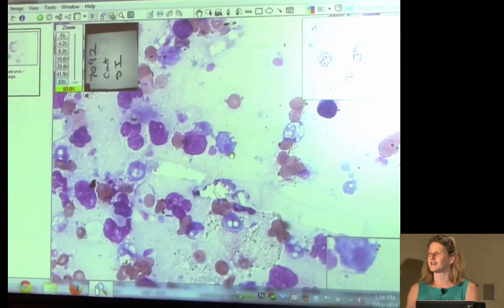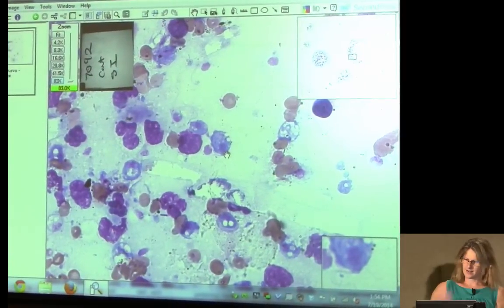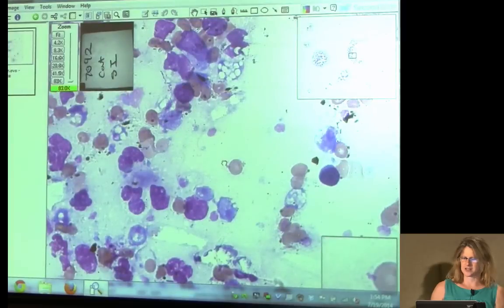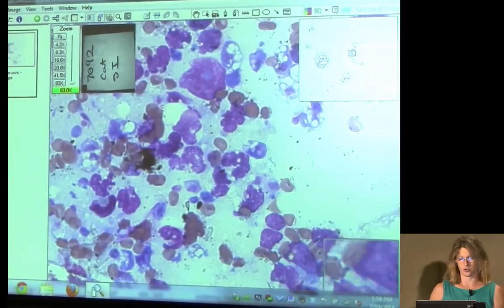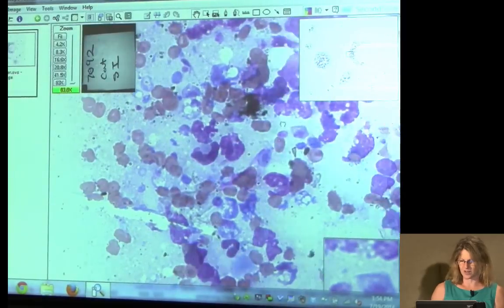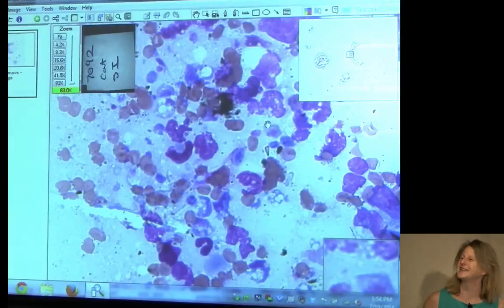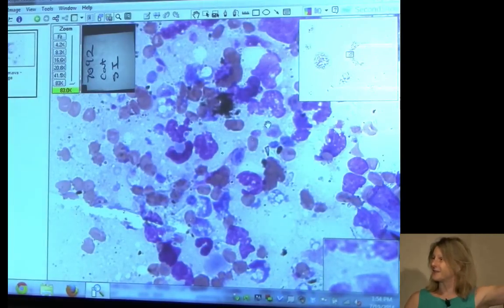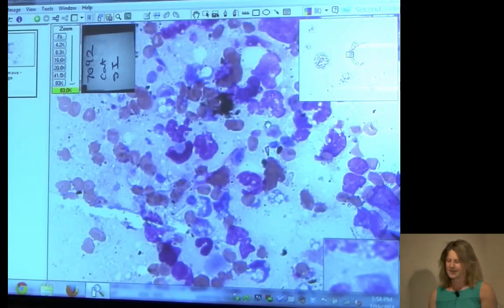But the 3 flagellae is pretty characteristic. And there are just a ton of organisms on it. He's a great source of slides. He just sent me a Clostridium piliforme in a dog liver, which is very unusual. That's also a horse pathogen, all these horse pathogens coming into dogs. And I'm out of time, but I just want to share some of the fun stuff that we get to see as clinical pathologists. So you see, we get really excited. And some of us really love critters. I'm like a cancer junkie, but I do like critters. But we call them our little friends.